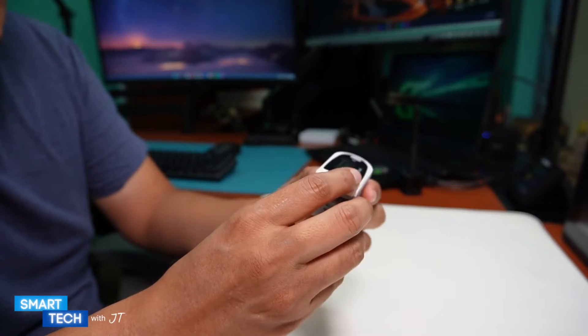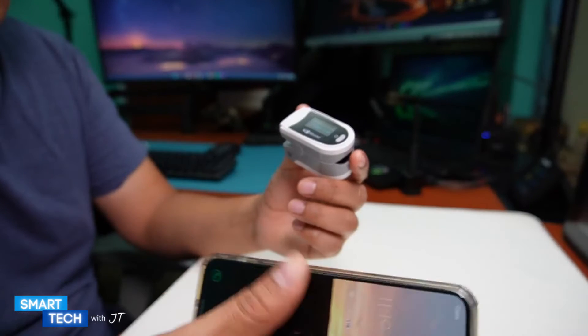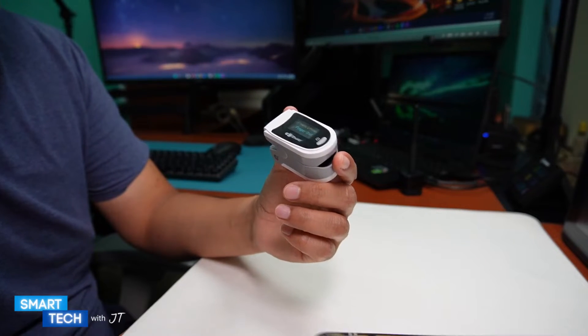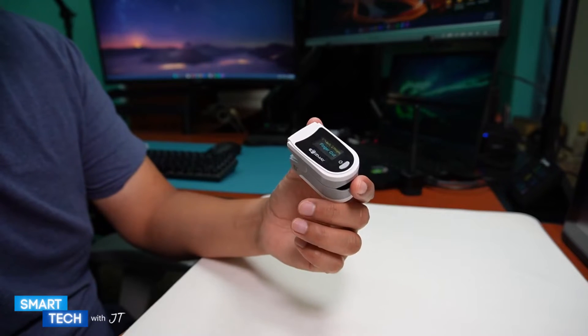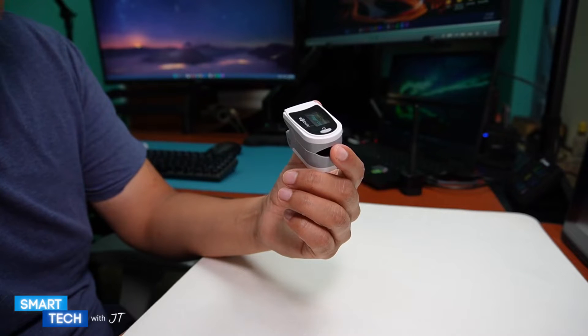It is Bluetooth enabled so you can pair it to your device, download all the data onto your phone, and transfer it to your doctor if you need it.